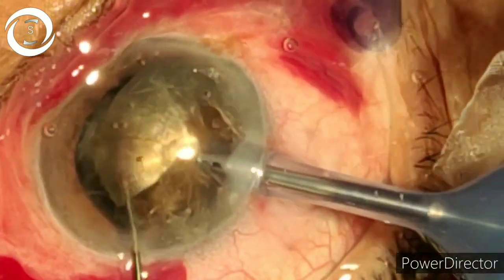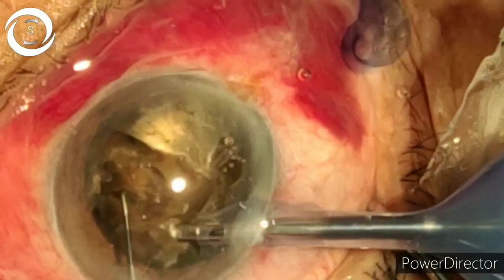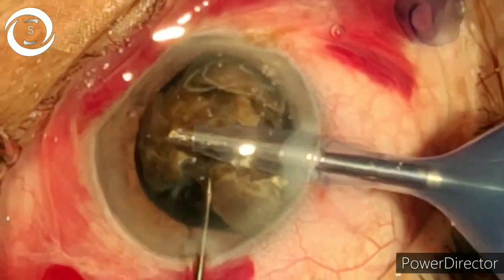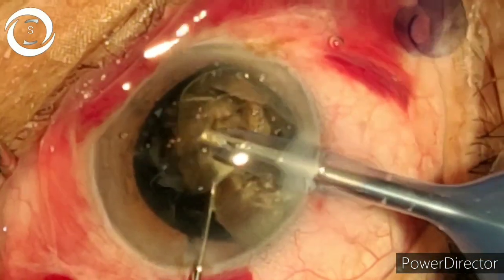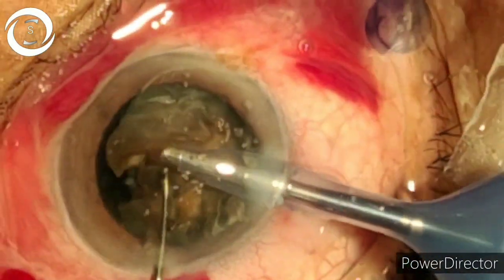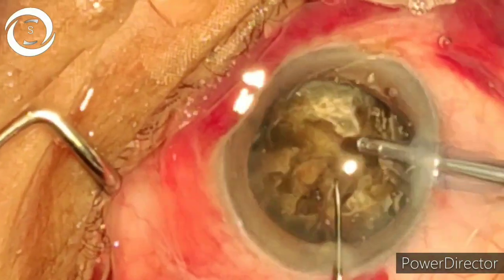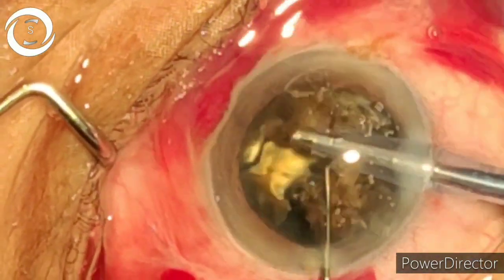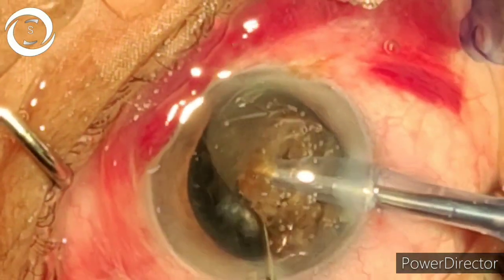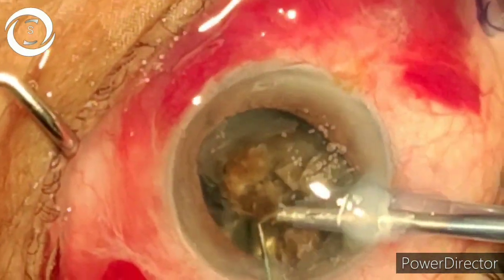That is called the tilt and chop technique. You can see the reddish center — this tells us that if the cornea had not been healthy I would have straight away done extracapsular cataract extraction without a second thought. But the cornea in this case was very good pre-op, so I decided to perform phacoemulsification with a lot of viscoelastic and high parameters, because if you do the same case with 60 or 50 feco power it will take a lot of time and will damage the corneal endothelium more compared to doing it at 80 or 90 feco power.